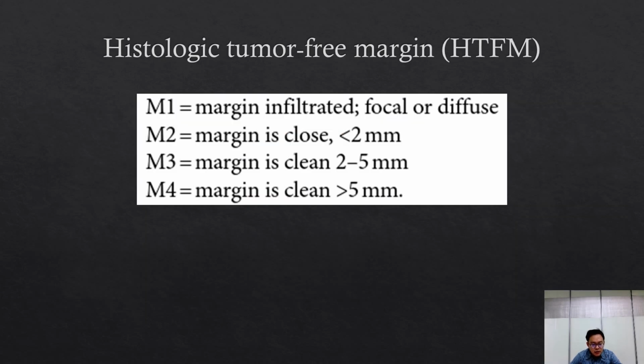The distance of the closest approach of the tumor cells to the histologic edge should be measured or estimated in the field of vision. This can be assessed along the cranial, caudal, both lateral, and the deep margins, and reported as the HTFM.